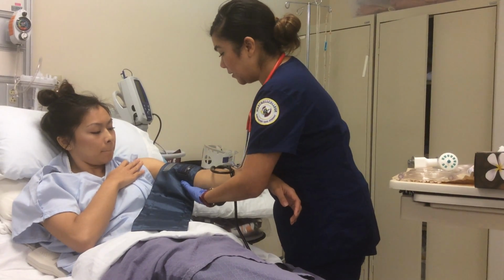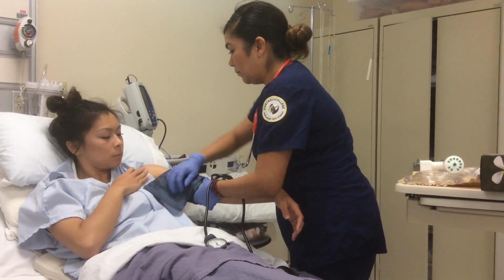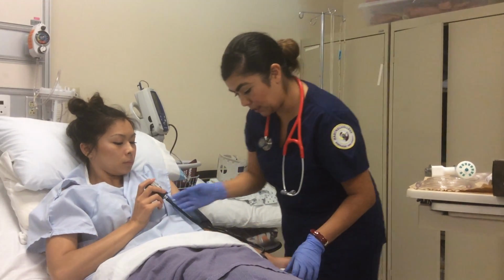Time passes, and then you come back and you close. So now you can turn off the machine. I am going to ask if it's okay with you, Diana, if you could just go ahead and hold this for me. Okay, I appreciate that. Thank you.